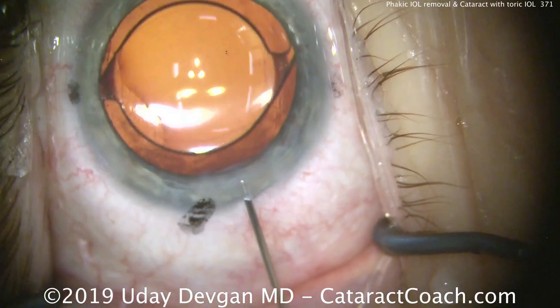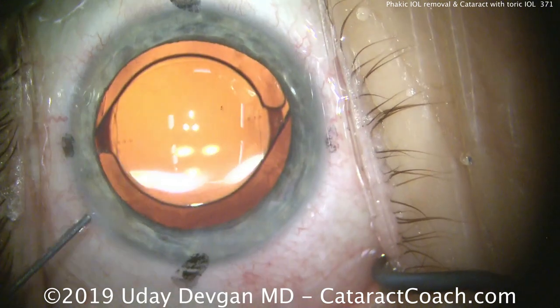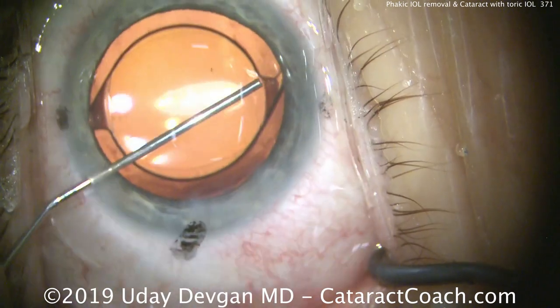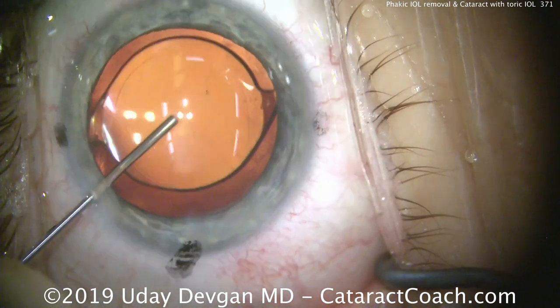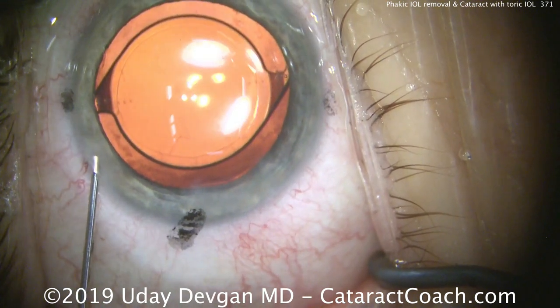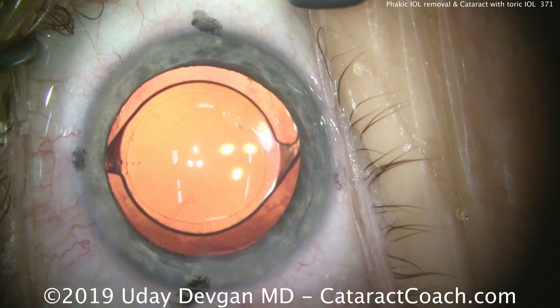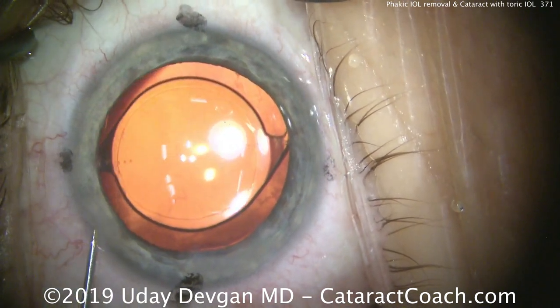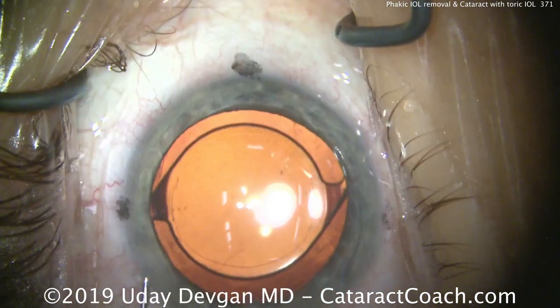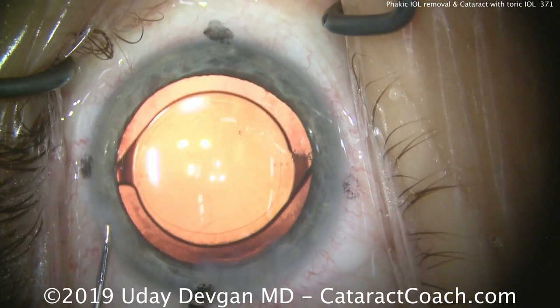We'll go through the side port to seal it as well, readjust the lens position if needed, and get the intraocular pressure at a normal physiologic level. A little sweep at the angle to ensure no viscoelastic remains. And if you look at that overlap — that is spot on perfect. Beautiful 360-degree overlap around the optic by the capsulorrhexis. Toric lens in perfect position, incisions are sealed up. We are done with this case and happy to congratulate the patient on a beautiful visual outcome the next day. We take pride in delivering our very best.